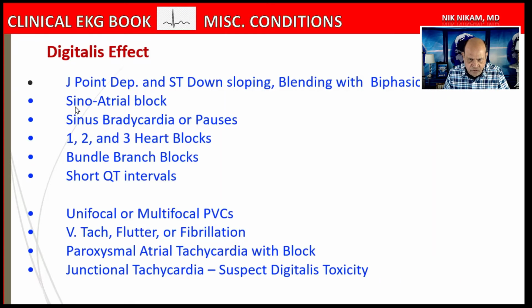We can have a sinoatrial block. We can also see sinus bradycardia or pauses. We can see various degrees of heart blocks, first degree, second degree, and even third degree. We can see short QT interval. Of course, ectopic beats coming from atria or ventricles.